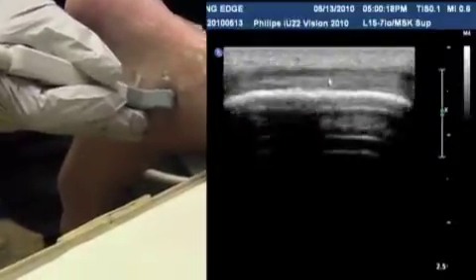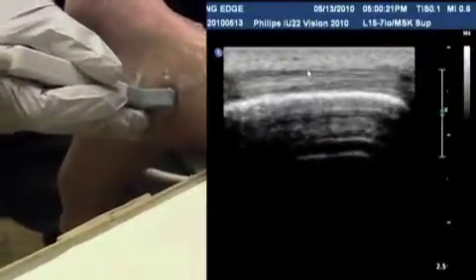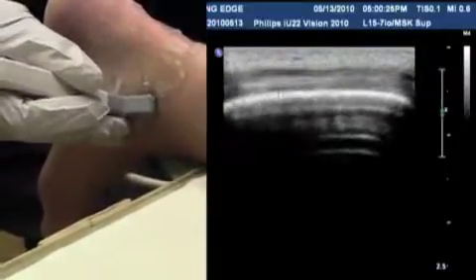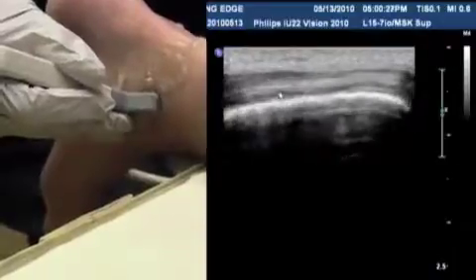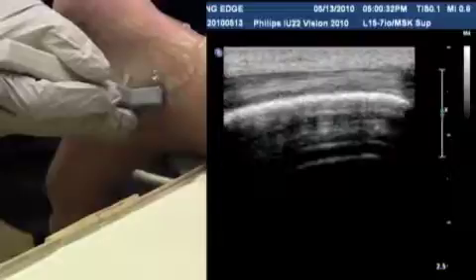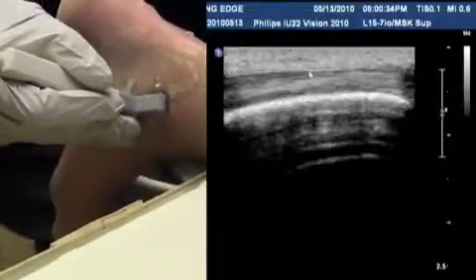Now what you also see usually in many tendons is a hypoechoic area on both sides. That's just a normal sheath, or the tendon sheath that you see. Most tendons have tendon sheath. The Achilles does not have a tendon sheath. So what happens many times, you'll have an inflammation of a tendon sheath and not the tendon.